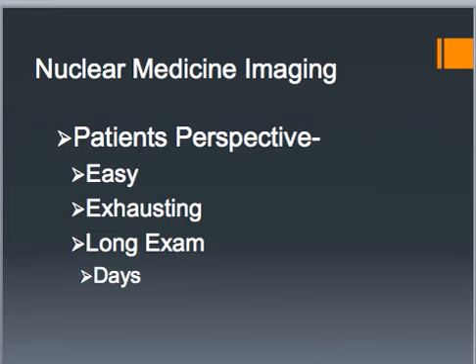After the procedure, a small device may be passed over the body, which is going to measure levels of radioactivity. So, they need to make sure that the patient isn't emitting radiation where they could be around other people. Most of the time, shortly after the procedure is over, they're fine. When I had my scan and they injected it into me, I had no issues going home that day and being around my family. I wasn't exposing them to radiation because it had already kind of dissipated in my body.